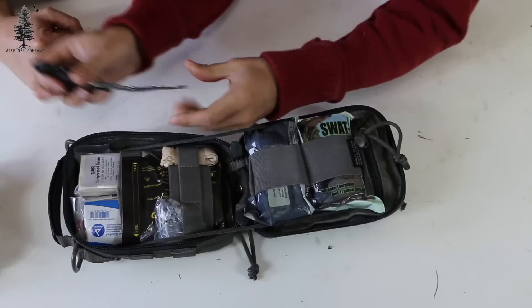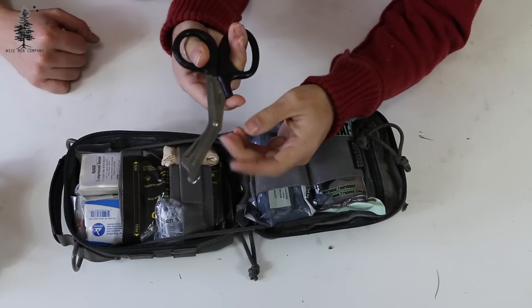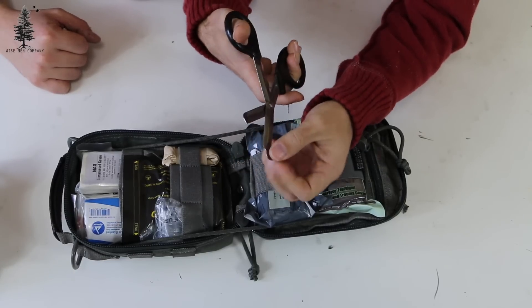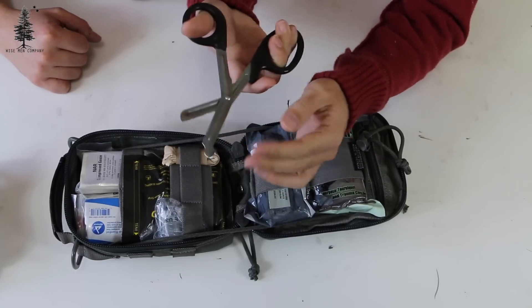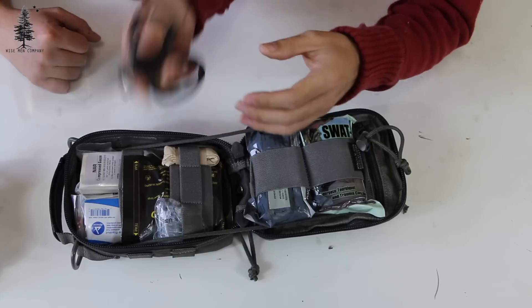Real quick, just again on the outside — these are five-and-a-half inch trauma shears. The nice thing about these, for those of you who don't know, is they're designed so that they don't cut the person, but they can cut the clothes, cut webbing, cut off belts, those kinds of things. It is nice to have those right there.